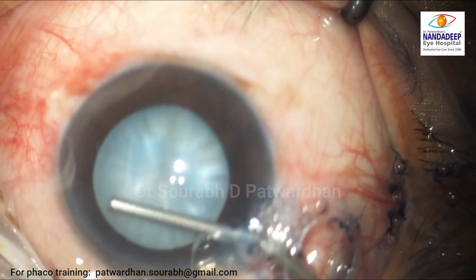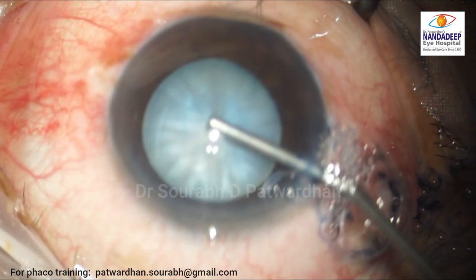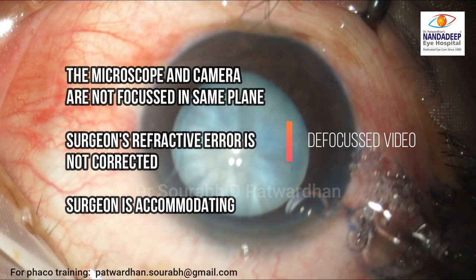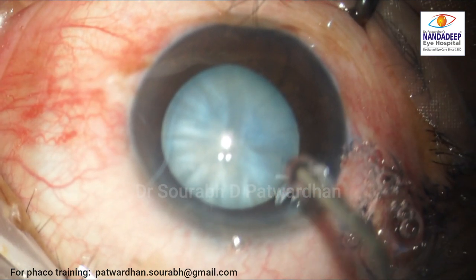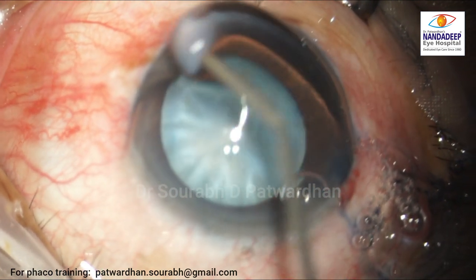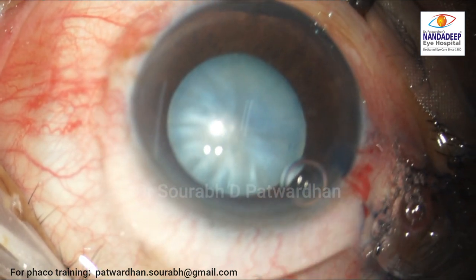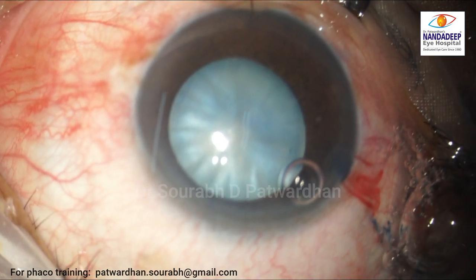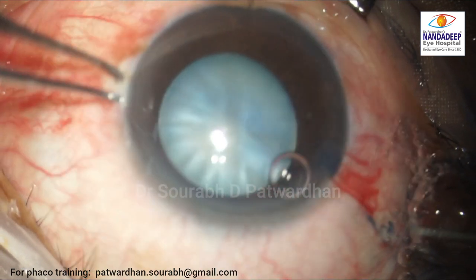Making a side port is a very good idea because the surgeon will be doing all maneuvers through the small incision. If you see, the video is defocused — some tips: the microscope and camera should be focused in the same plane, the surgeon's refractive error should be corrected with glasses, and the surgeon should relax so that accommodation does not cause defocus on the video.